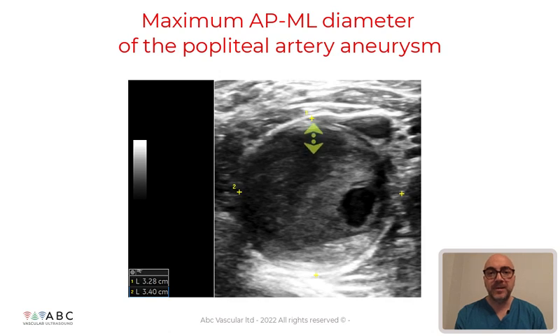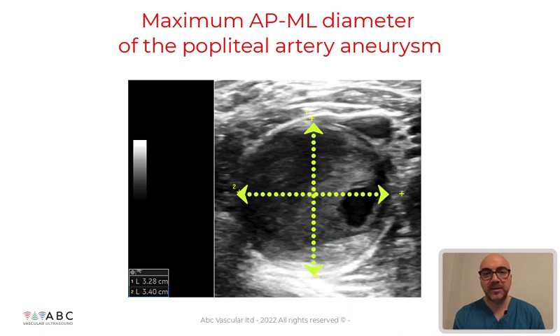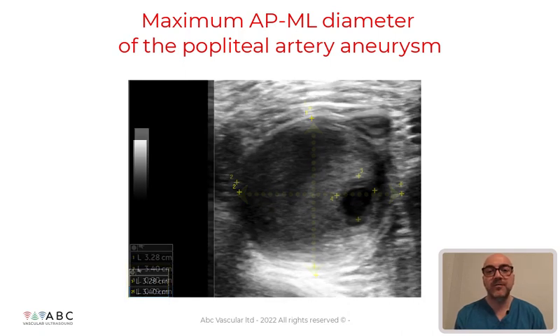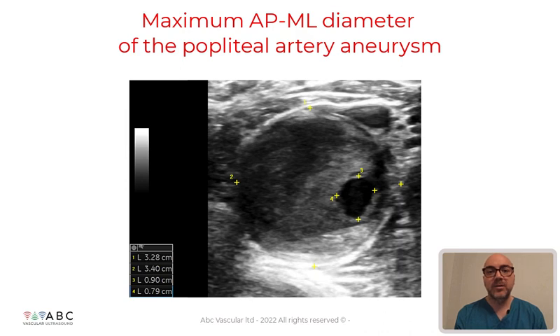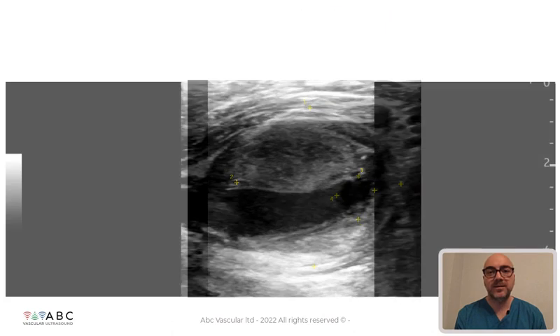By freezing the image we can measure the maximum anteroposterior and medial-lateral diameter of the aneurysm, which are 3.28 cm and 3.4 cm. Moreover, we can also measure the maximum anteroposterior and medial-lateral diameter of the patent residual lumen, which are both less than 1 cm.